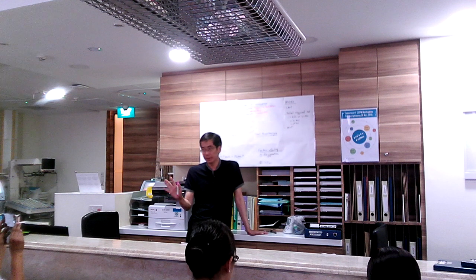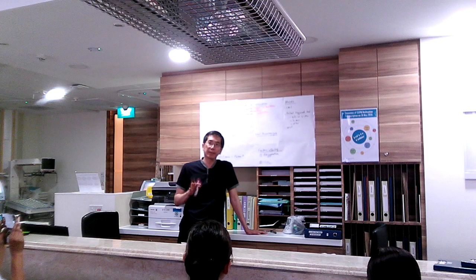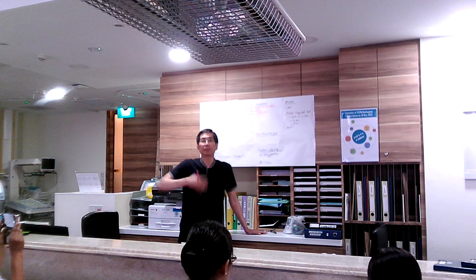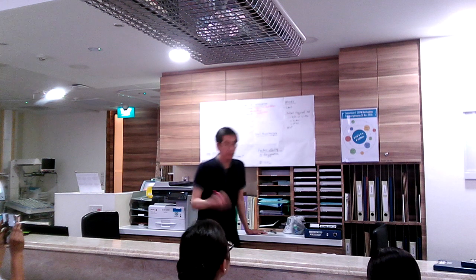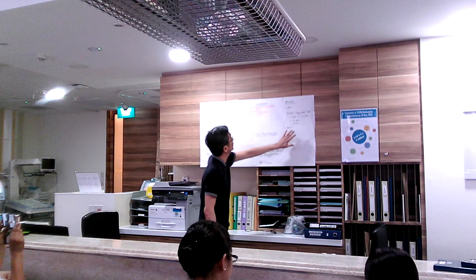It's not easy to understand, and I'll explain to you later, but basically it is a method of supporting the breath which is supposed to be more natural, more in tune with the baby, and it's supposed to follow the baby's breath, because baby's breaths are never exactly normal. Sometimes they take bigger breaths, sometimes they take smaller breaths. So the support of the breath is supposed to follow the baby's breath. So we'll talk about that later. It's not easy to understand how it works, but we'll try.